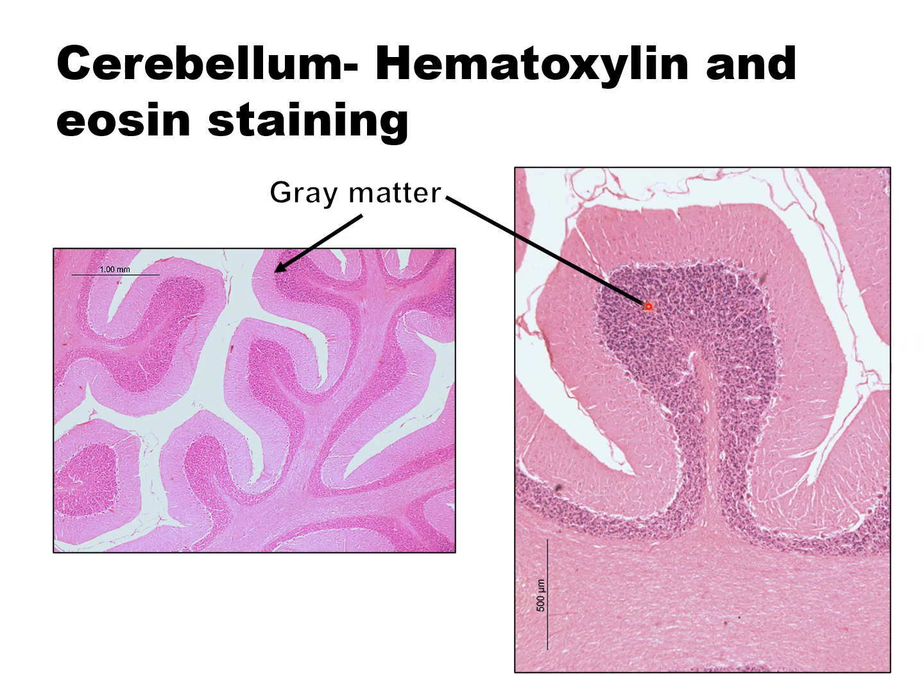So the darker area is the gray matter, and from the gray matter the axons come out and form the white matter. The whole area of this folia is just like cerebral cortex. The cerebellum has three layers: the outer molecular layer, Purkinje cell layer and the granule cell layer.